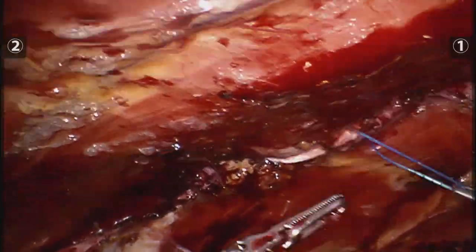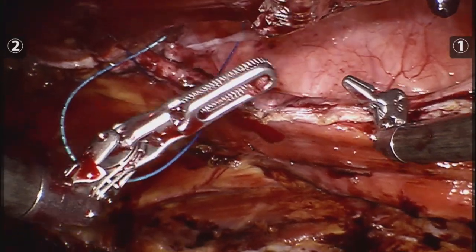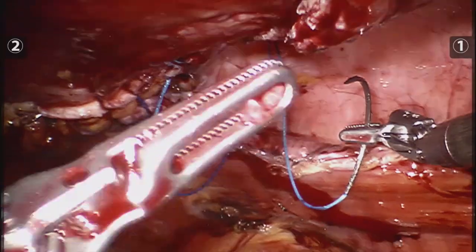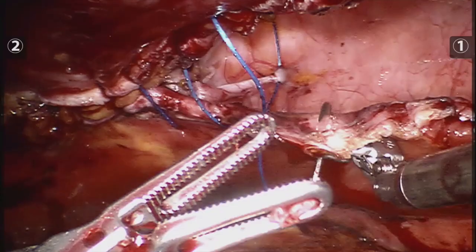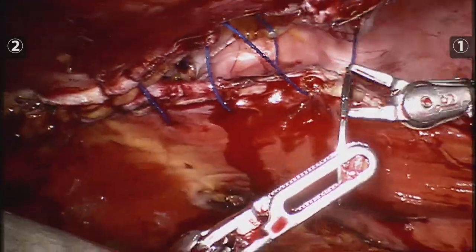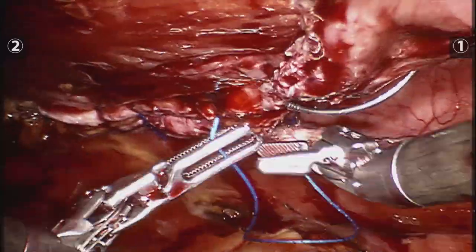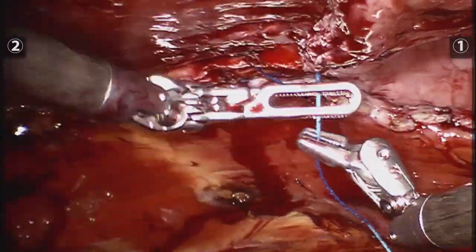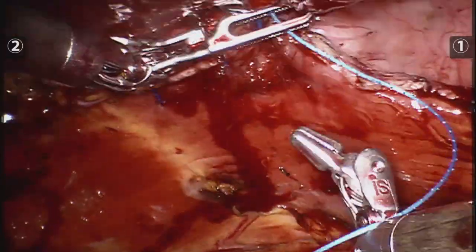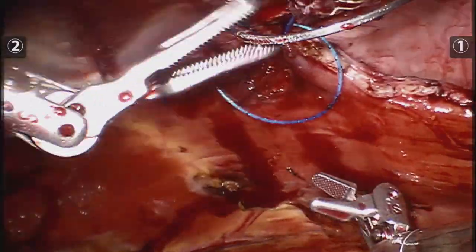While doing this part of the surgery I was thinking about when I do these procedures in laparoscopy. It really makes a difference — the articulation you can do with the hands when doing it robotically. I think there is no contest that the robot is much better for any complex hernia repair than laparoscopy. But I do think laparoscopy should be in your skill set and a very important part of the learning curve, because it's a better way to understand the anatomy and you appreciate the robot a lot more once you've done these procedures laparoscopically.